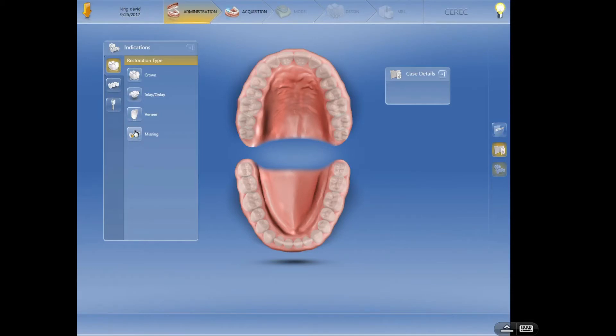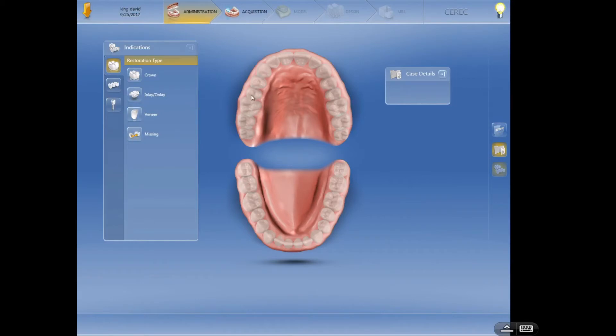It's a tooth that does not exist in the mouth because it was removed and the space was closed. So for instance, if we had a tooth number four that had been extracted for orthodontic reasons and then three and five have been closed, then we could click missing and select tooth number four. Anyway, so that being said, I would leave this alone. I've only used this once in 10 years. Ignore this missing button.